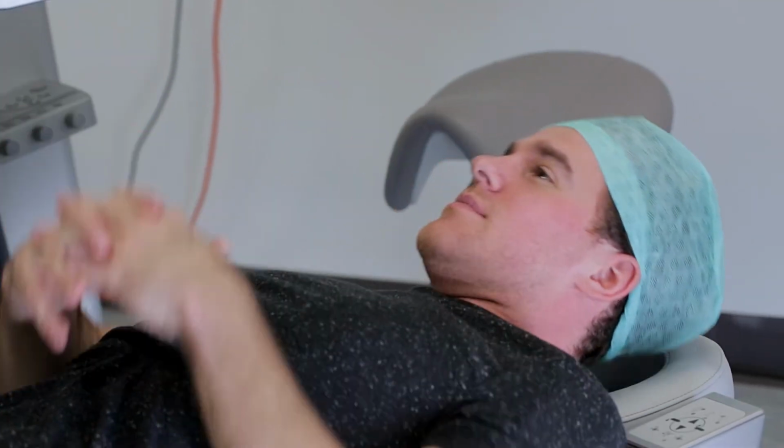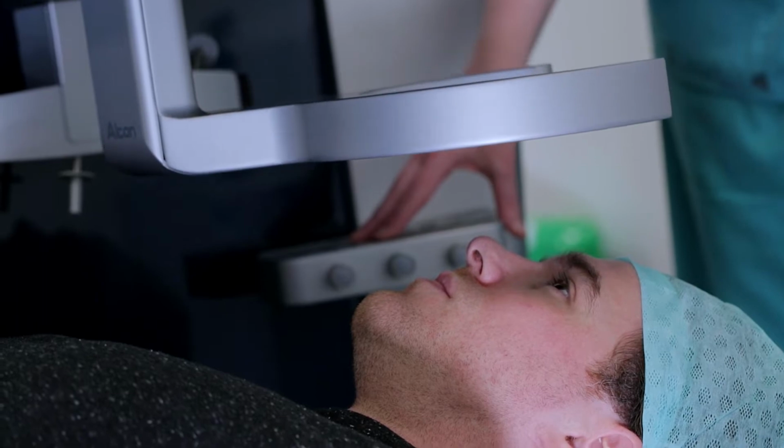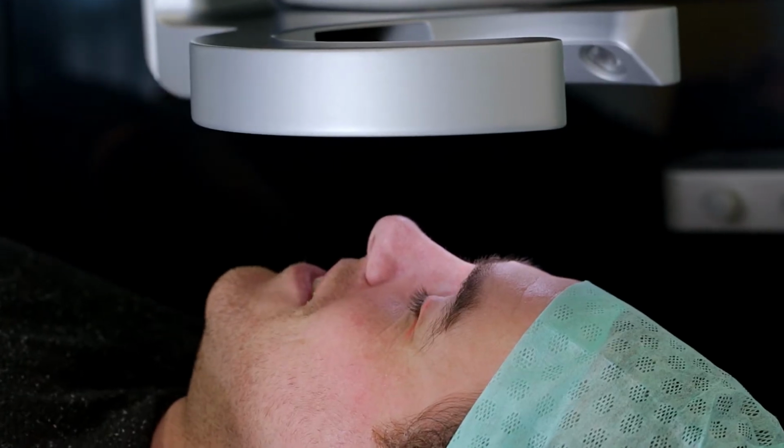At your first appointment, you'll come with us for a tour of the laser suite itself. You'll have a chance to lie on the laser bed to talk through what you'll actually see and experience and feel and hear on the day of your laser treatment, so that when you come to the treatment itself, it's all familiar and you know what to expect and everything goes as planned.